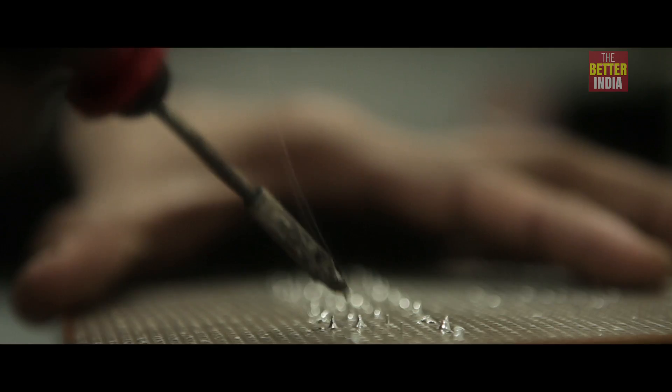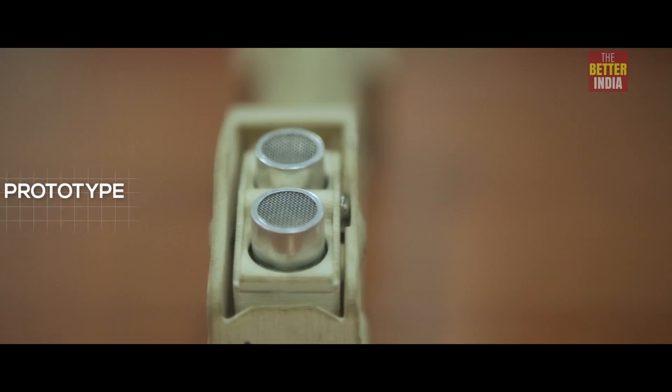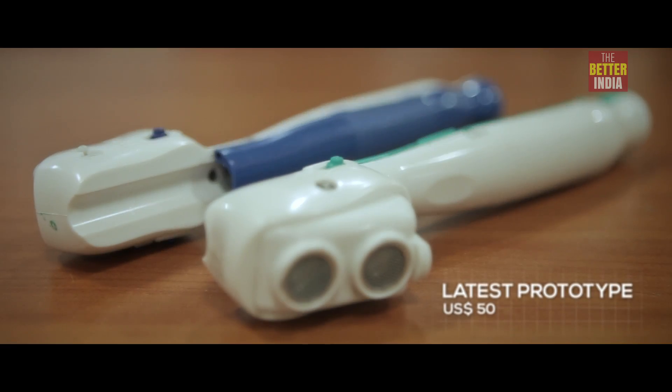In the development of the SmartCane, different users in different parts of India used it and gave feedback. It had to be something very subtle and lightweight.